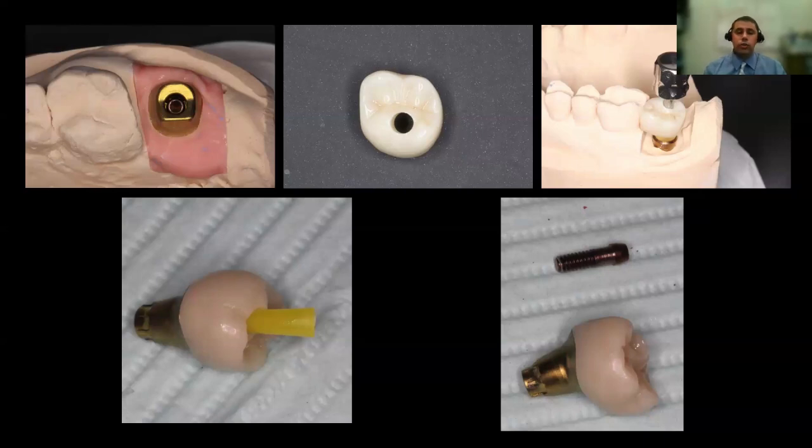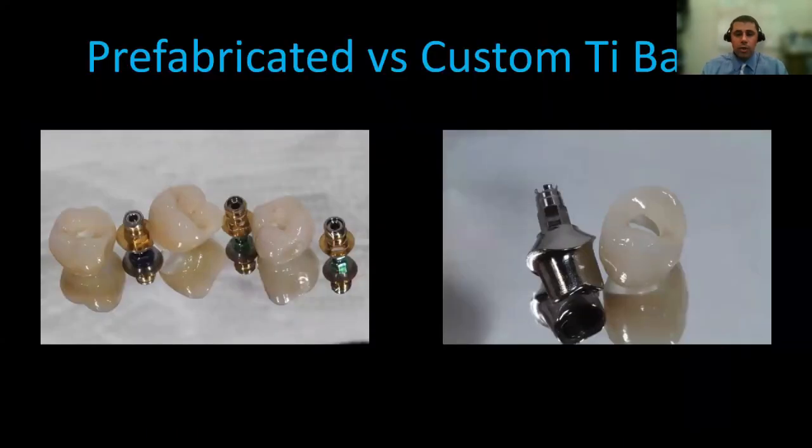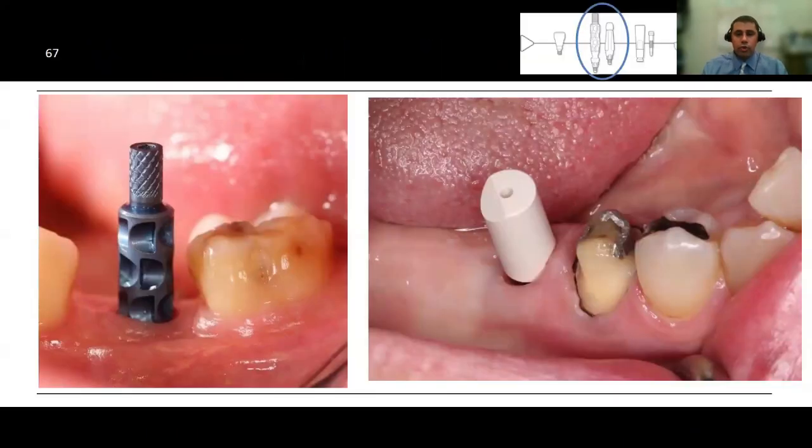The advantage of that is you could place the abutment, place the restoration, do all your adjustments, proximal contacts, occlusal contacts, do the final finishing and polishing of the restoration, then cement it. Or it can be delivered as one piece by the abutment already cemented in place. Obviously, if you have tight proximal contacts, if you have to do any adjustments, you may have to then seat and remove the restoration several times. So there's advantages for each one of those approaches.